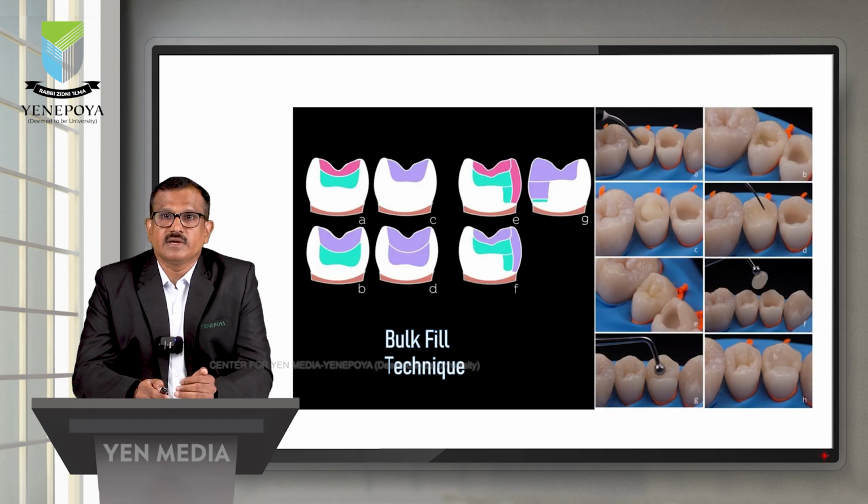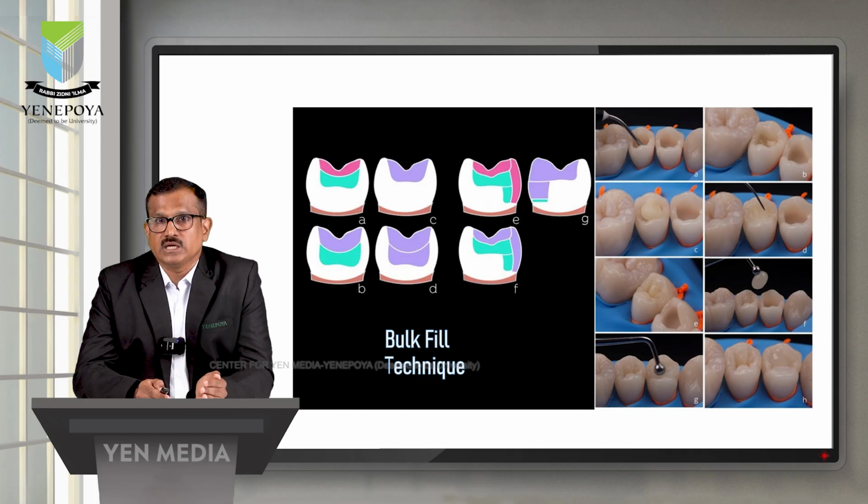This is the bulk fill technique, for when you don't have time or certain people are not very skilled. What you can do is build one dentine bulk layer inside and an enamel bulk layer on top, roughly contour it, and then use your trimming instruments to make the shape and give the final finish. This might be a good option for post endo restorations for the time being.